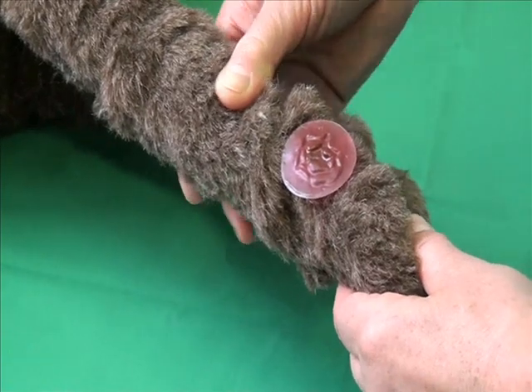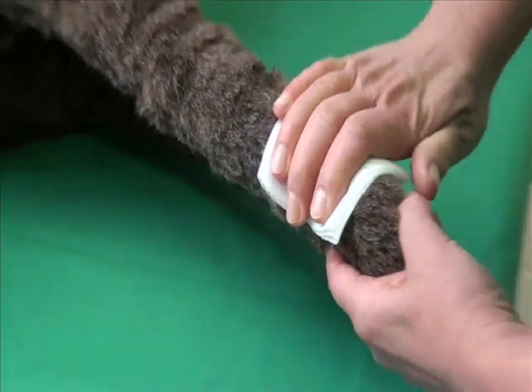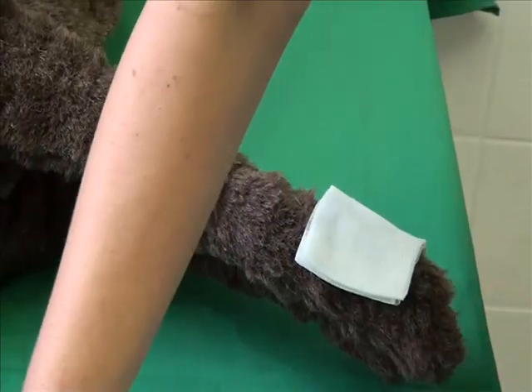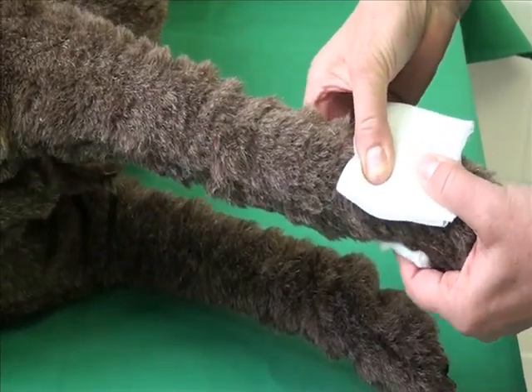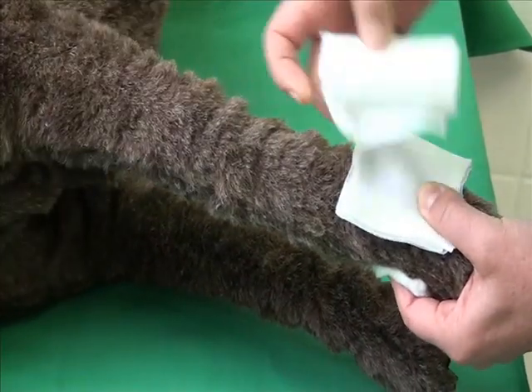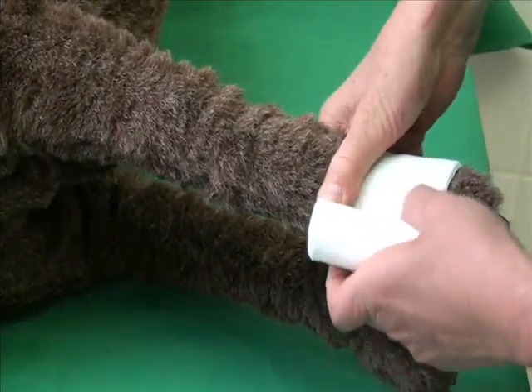In the real animal, the animal and the leg should be held by another person. The animal should be in lateral recumbency with the leg to be treated uppermost. An appropriate wound dressing is placed on the wound and covered with a swab. In this example, the wound is on the lateral limb at the same level as the dewclaw, so padding for the dewclaw must be provided at this stage.